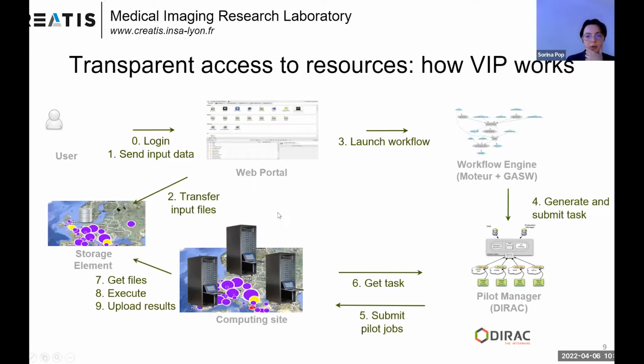And how does this integrate in the big picture? So you as an end user, you only see the web portal, right? We will log into it and then select an application that we will launch. And behind the scenes, each VIP application is described as a workflow.